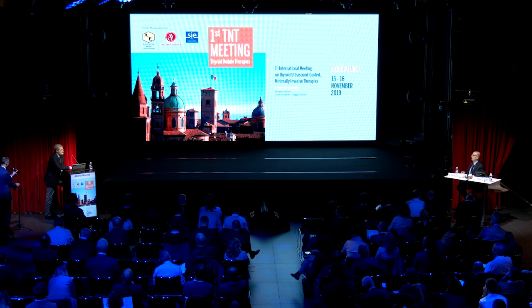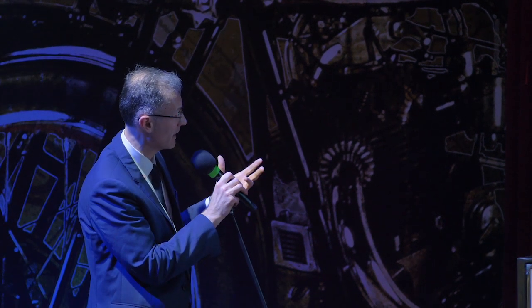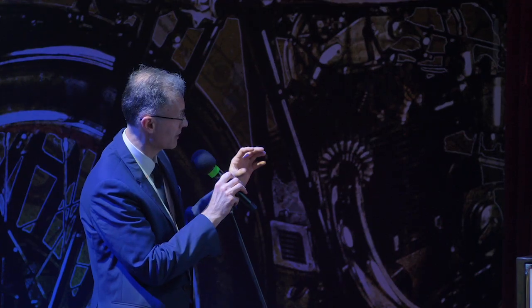Other questions? Mario Stan, USA. This has to do with the temperature that you described, reached in the tissue, up to 105 Celsius. There's an ongoing discussion between some of the people performing the procedure about what happens with the thyroid hormone that is released at the time of this tissue destruction. In particular, the more tissue you ablate, is it likely that bioactive hormone is still released, or do you think the three-dimensional structure is distorted and it becomes inactive?